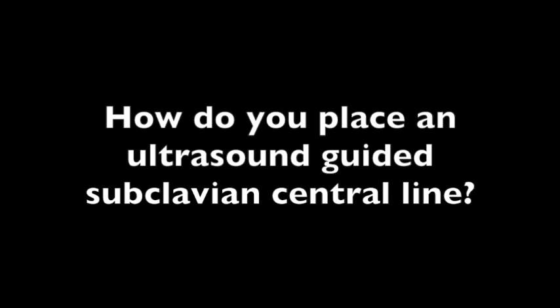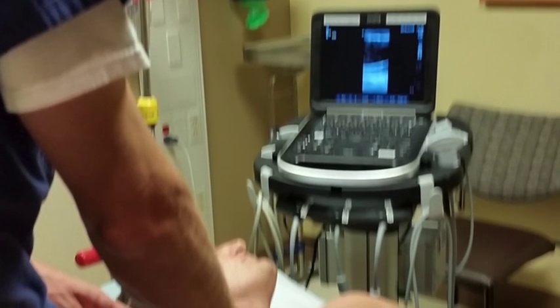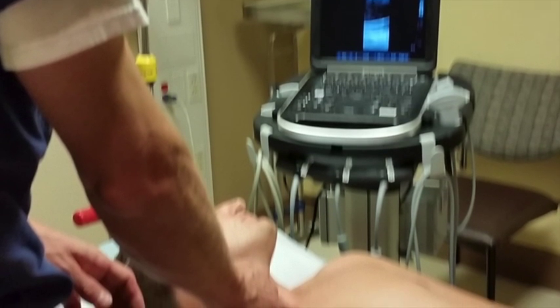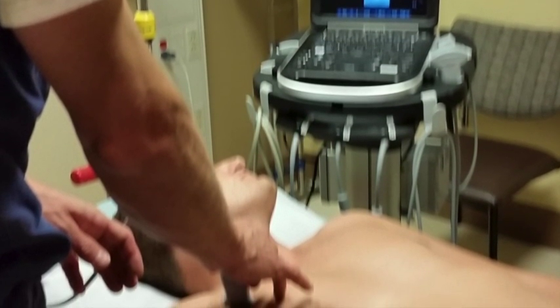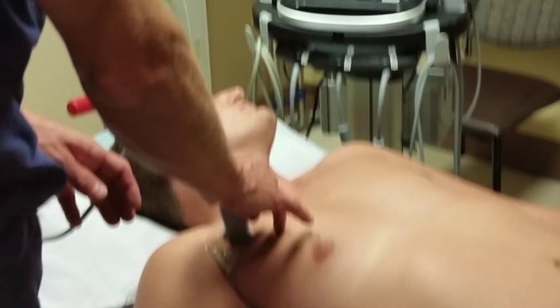This is another bit of ultrasound with Z. This time, how do you place an ultrasound-guided subclavian central line? It is easiest to have the ultrasound machine placed on the other side of the patient from which you are placing the line. This will help a bit with orientation and keep plenty of space free for your equipment.